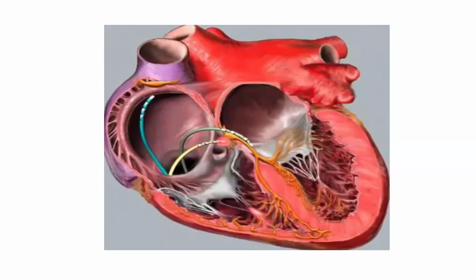Okay, great. So I was trying to say that we can have a catheter in a chamber, and we can fragment the reading. Just the same way you can have 3-lead ECG, you can have 6-lead ECG, right? You can also have 12-lead ECG, right? So the same way we can do for the catheters in the EGM. So for example, for the high right atrium, we can fragment it into 3: distal, mid, and proximal. The same we can do for the His bundle. So you can have the proximal His, mid His, and distal His.